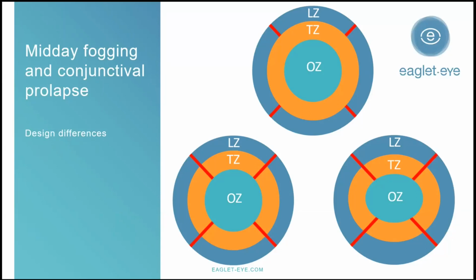Can I ask how many of our users at the moment, for example, work with the bi-elevation map from Zen Lens? What are your experiences with that when you fit that particular lens type? Well, I fit 3 pairs of bi-elevation Zen Lens. It was first fit success, except my last one, that is this week. I have totally limbus bearing, 360 degrees round.